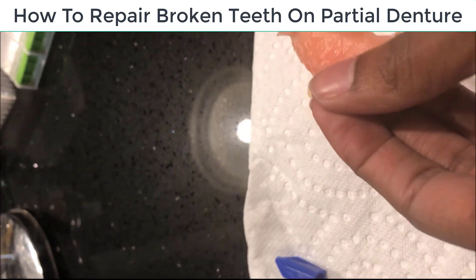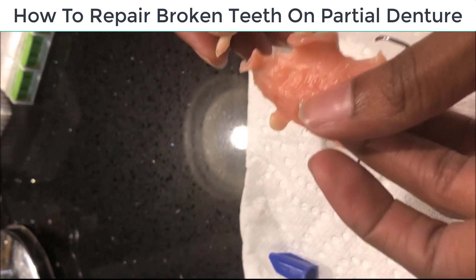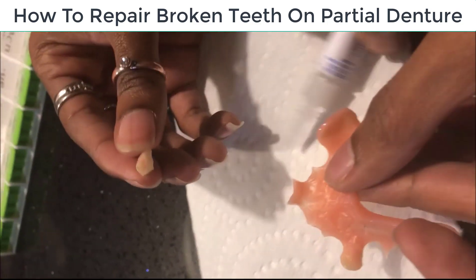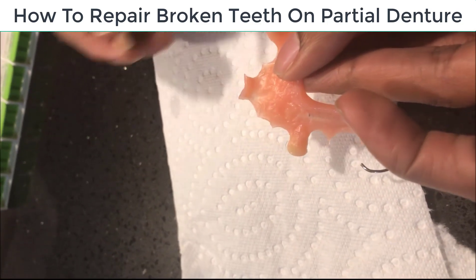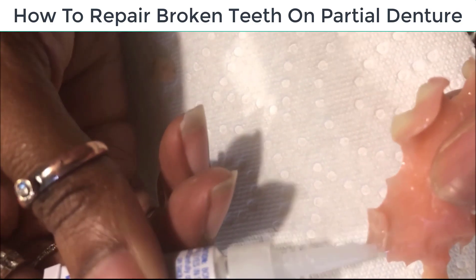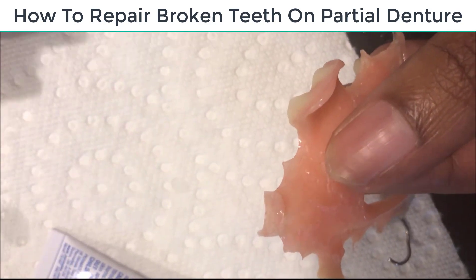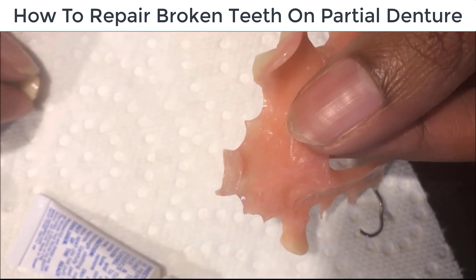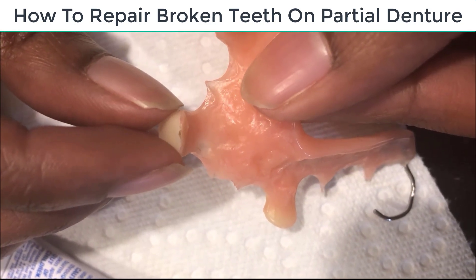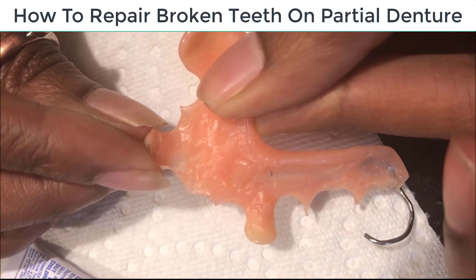So the only thing we did — and like I said, it's been a couple of months ago and this thing is still holding on, it hadn't broke. She wanted to give it a try. So what she did, she took the super glue and put a little bit on. It don't take much. And you take the teeth and you hold it on for probably about 15 or 20 seconds until it starts bonding.